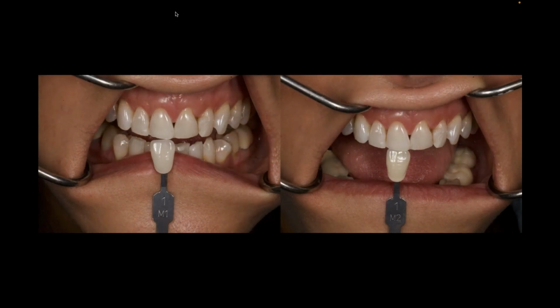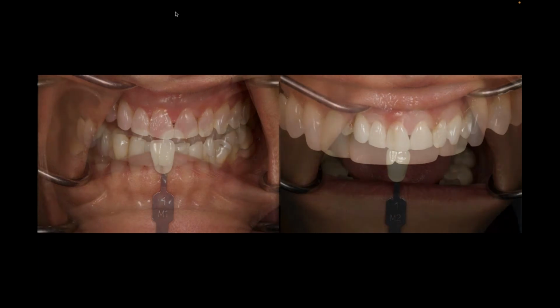We're doing 4 or 6 teeth here. It was 4 teeth, so I don't need to be as specific with my shade taking. You can see the doctor used a 1M1 reference for the basic value. They also put a 1M2 in there because they're looking at the chroma that's coming through and they shot it a little darker. So I can start to see some of that chroma scope coming through.